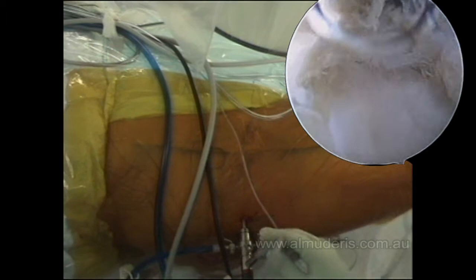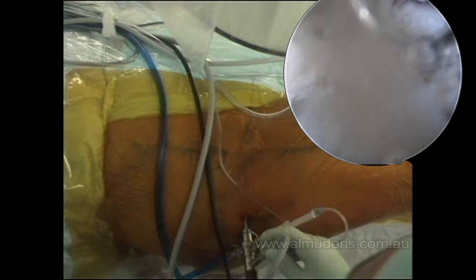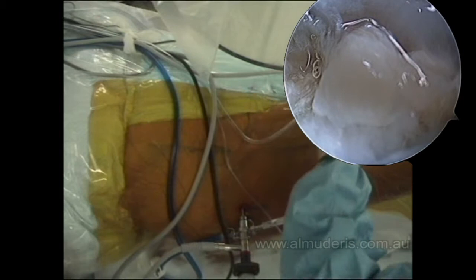We can see now we are inside the joint and there are significant changes. You can see the femoral neck — that's the edge of the femoral head-neck junction. This image will clear gradually once we insert the second portal.